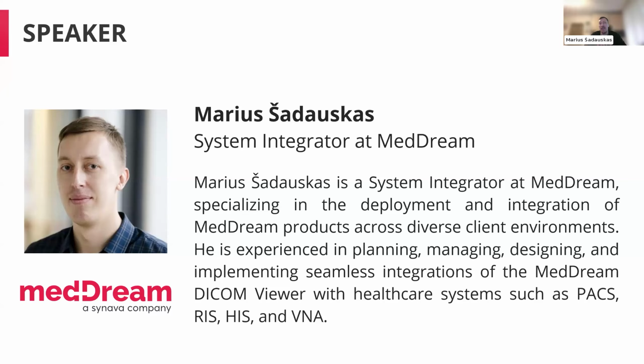Regarding our collaboration, I would say this is a very good example. It started this year at the ACR show. I think Vyacheslav was the person who was in contact with Reid. We had only a few face-to-face and online meetings, during which we presented the MedDream Viewer and the integration options.